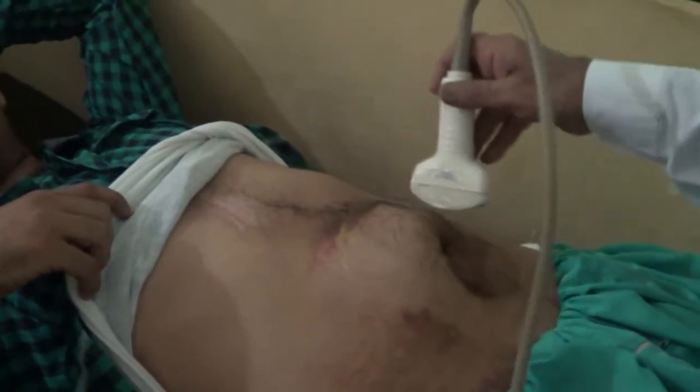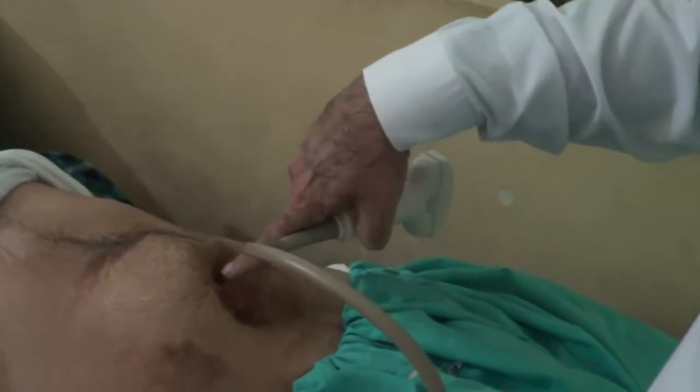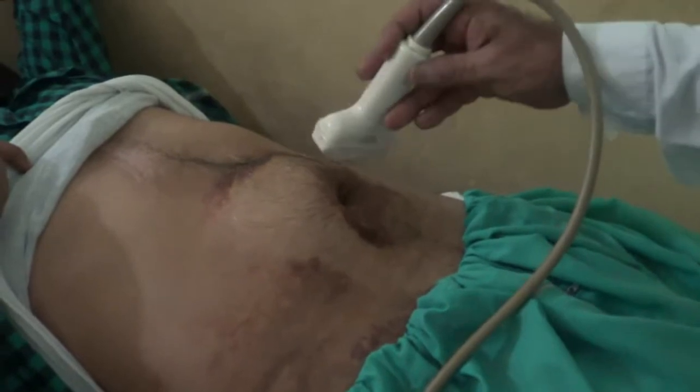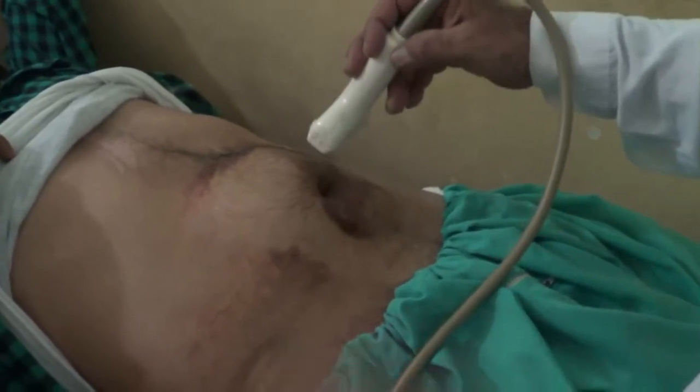27 years old man presenting with the history of trauma at a roadside accident about 7 days back, and has a lump at the midline. This is the umbilicus, this area. So it goes into the midline, expands both sides, and it's bulging. So we have to basically see now whether it's extraperitoneal or intraperitoneal.